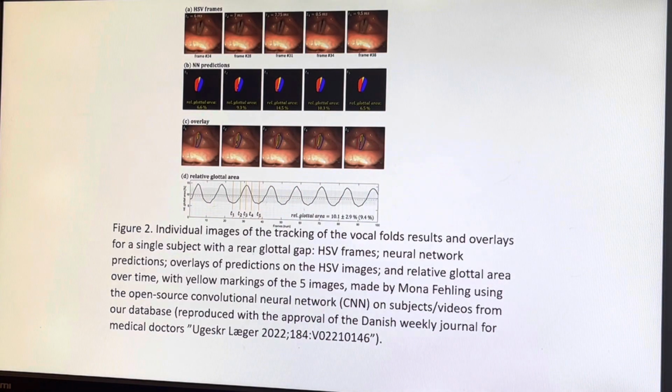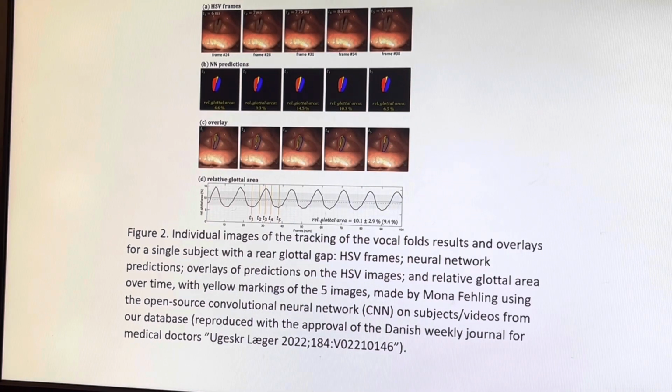The deep learning program was based on high-speed video with 100 continuous frames during phonation of each subject. The video was taken with a commercial setup, Endocam 5562 from Wolf, Germany, which records a maximum of 2 seconds in 256 times 256 pixels. We used 4,000 frames per second in full color, recorded trans-orally using a 90-degree rigid scope on the intonation of A and with the frequency of spontaneous speech.